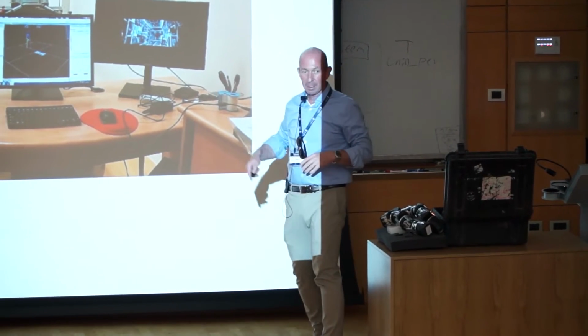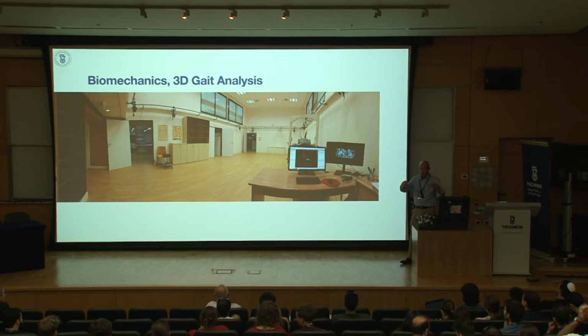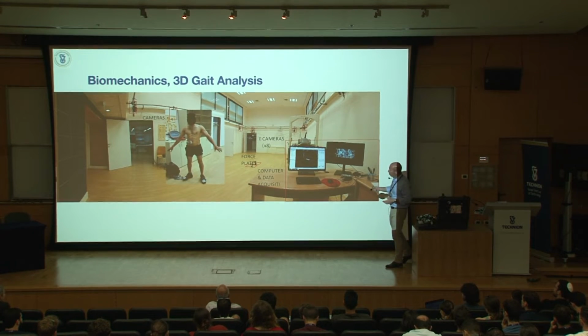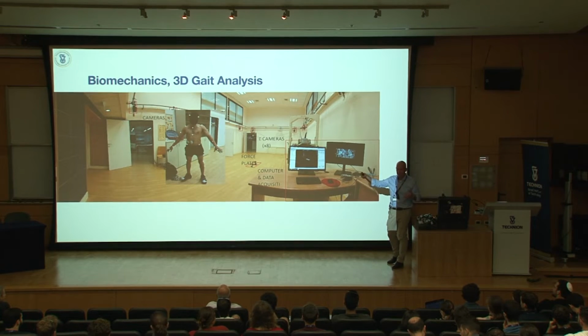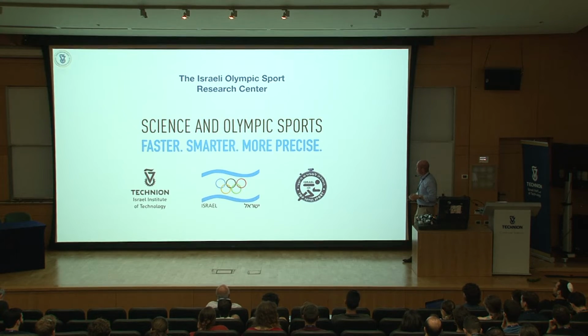We also have a very big gait motion capture lab, I mentioned it, with a camera system in the circumference of the room that tracks the motion of objects, whatever we want to track in the lab. We have other sensors like electromyography for muscle activity and force plates, etc. The markers reflect back the light that is emitted by the camera. By the way, it's the same technology that Hollywood uses to do all those animations. We buy the cameras now on eBay after we know that Disney released a new video. We look for the cameras, and we buy them for 10% of the value because they sell them after each production.